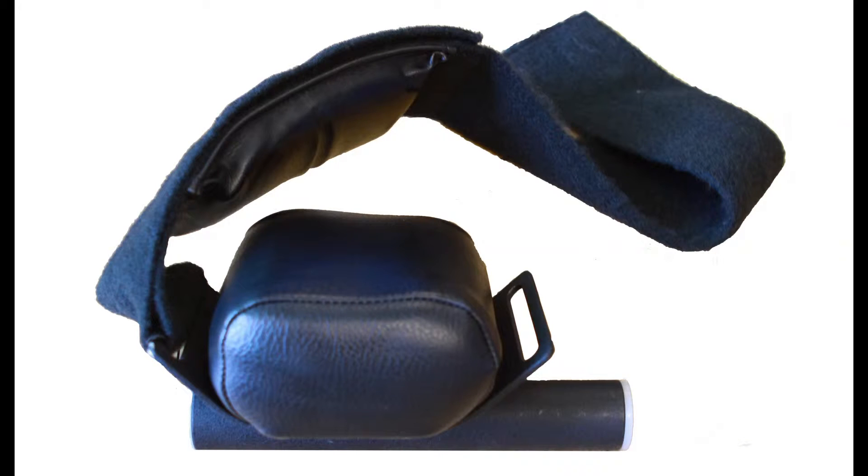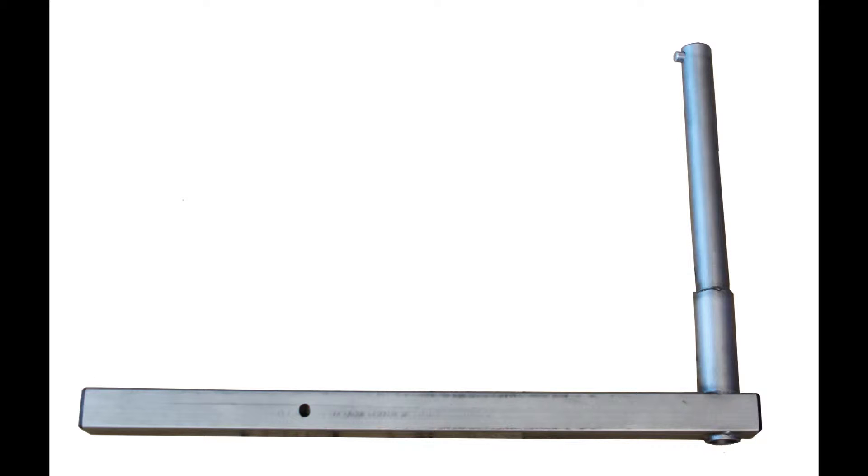For hip ab/adduction we will need the knee stroke hip pad and the knee hip adapter. These are often left attached to one another.